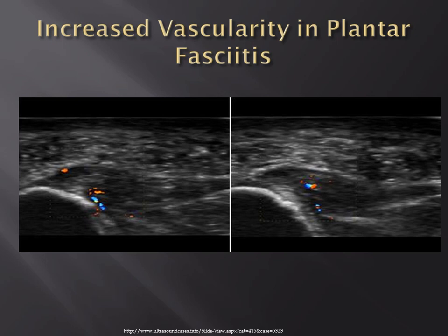Doppler is helpful in evaluating tendinopathy on any site with increased neovascularity, but certainly so in the plantar fascia. And this is an example of using Doppler to demonstrate increased vascularity at the calcaneal attachment of the plantar fascia.